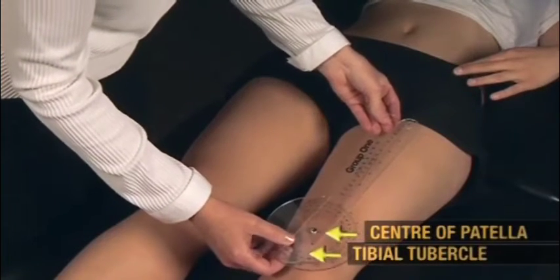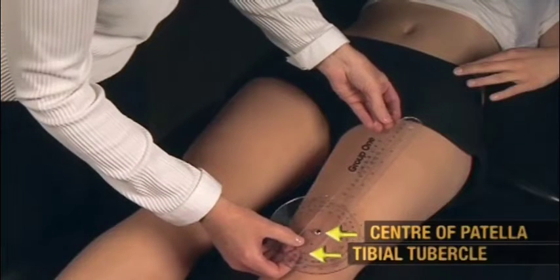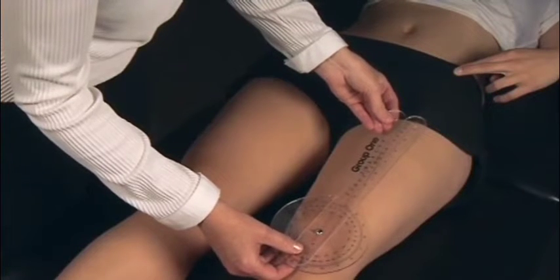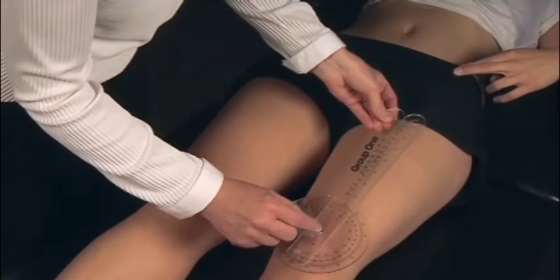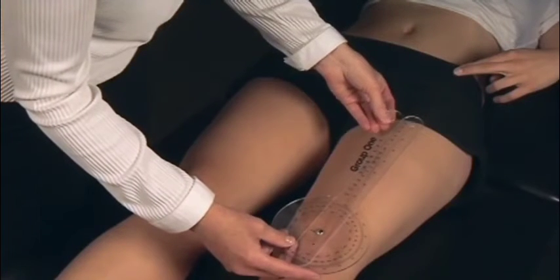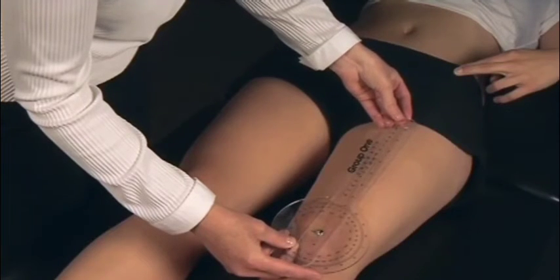The center of the goniometer is then placed on the dot on the center of the patella. One arm of the goniometer is aligned with the anterior superior iliac spine and the other is aligned with the tibial tubercle. The angle is then measured between the two lines, which in this case is 8 degrees.